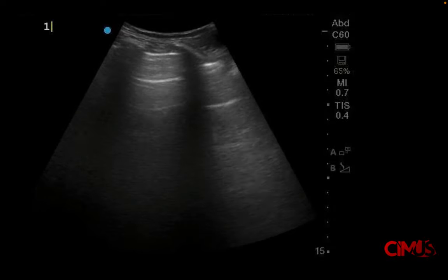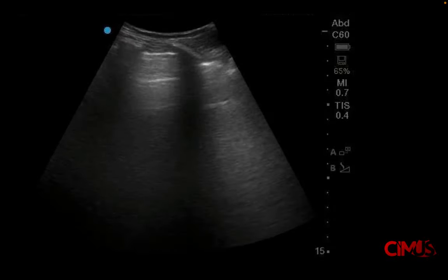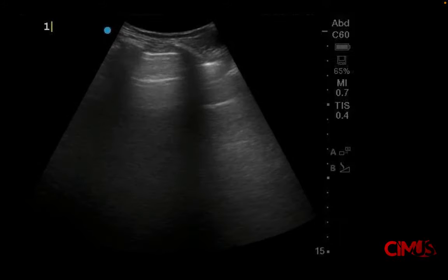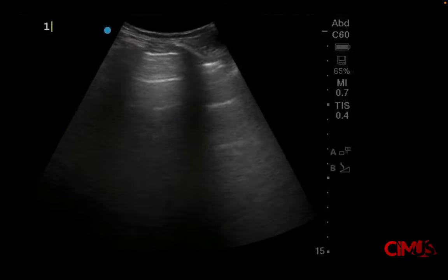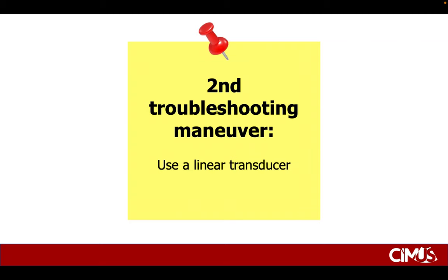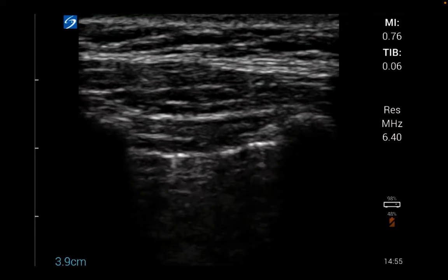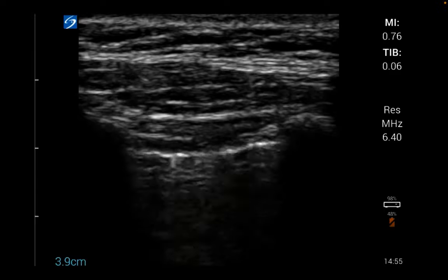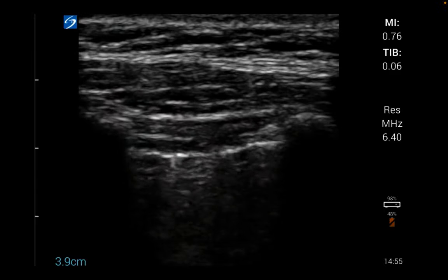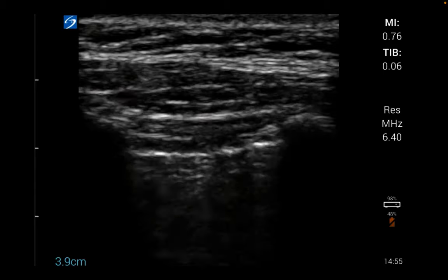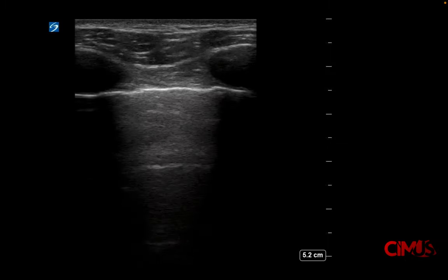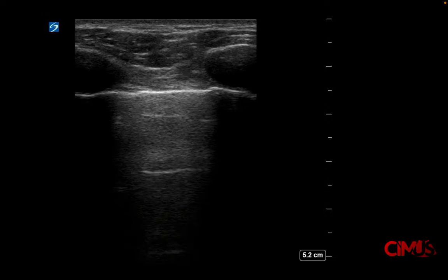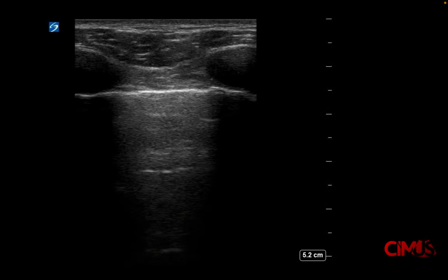Unless you can readily see lung sliding in a clip with a lot of depth, if there's any doubt at all, decrease the depth. If you still have trouble visualizing, the second troubleshooting maneuver involves switching to a linear transducer. Here's an example of a patient with clear lung sliding readily visualized with a linear transducer, compared with a clip of a patient with pneumothorax where there's no sliding visualized.